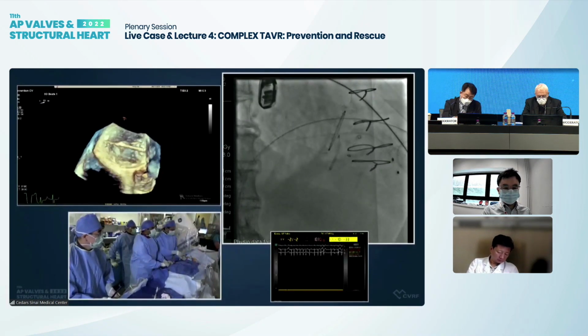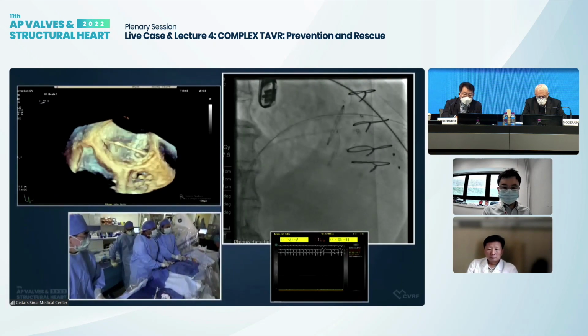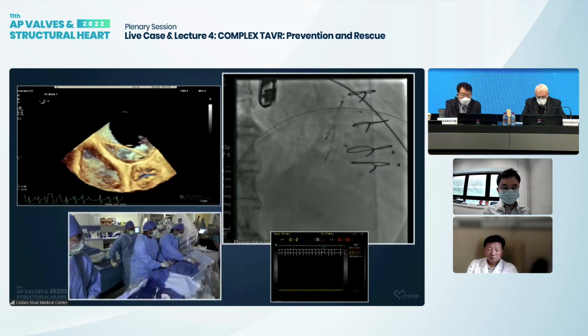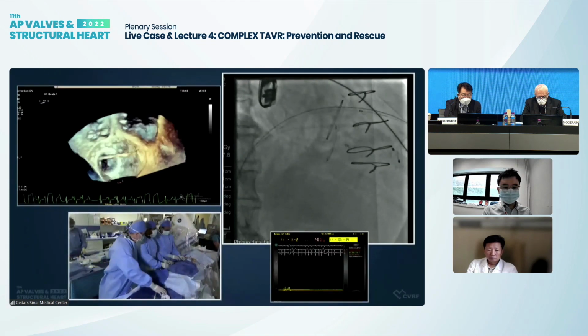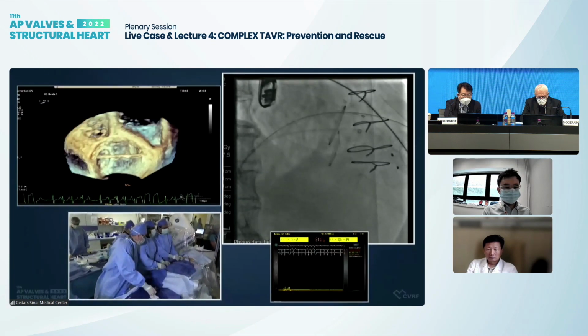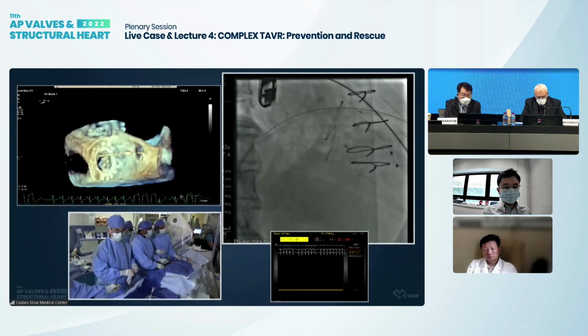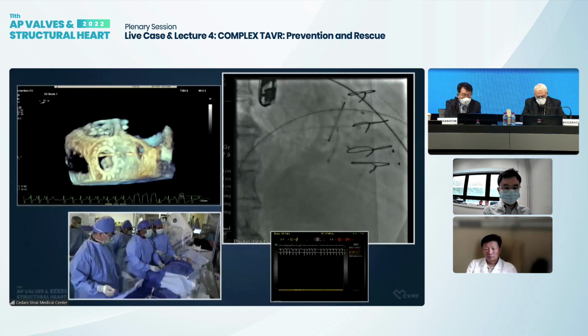All right. Now, where is our pressure from the micropuncture? Okay, let's come out with this balloon. Yeah, we'll give that in a moment. Okay, we had it for the gradients here. Okay, very good. Let's walk this out. So Jubin is walking this catheter out now, the Agilis catheter, while I'm just holding the sheath.